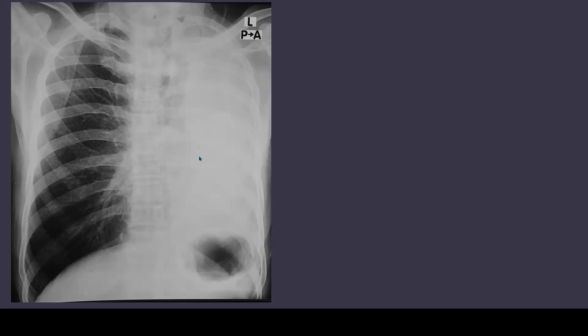Another thing of note is that the heart shadow is not at its usual place. The heart is probably somewhere here, which means the heart is also shifted towards the left side. All of these signs point towards volume loss, which means that the volume of left lung has reduced, which has resulted in shifting of mediastinum and diaphragm.